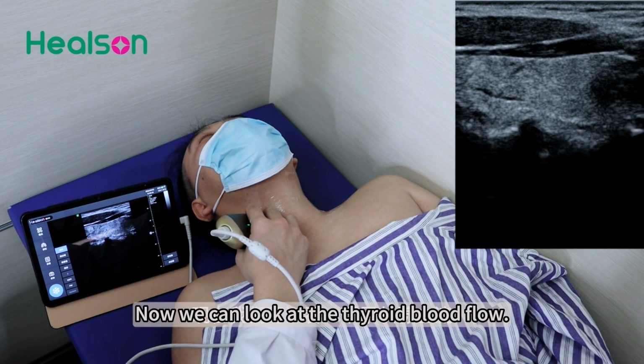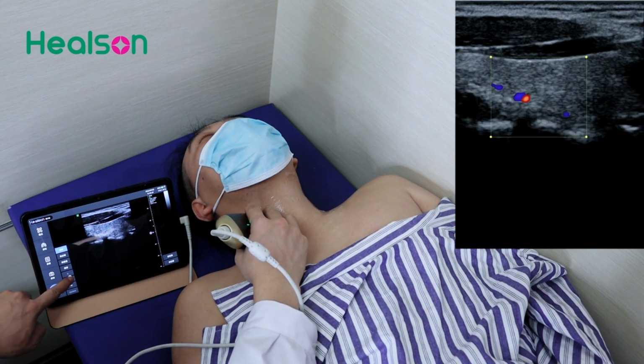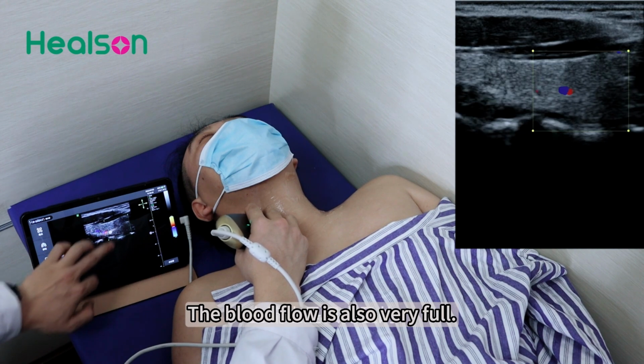Now we can look at the thyroid blood flow. The blood flow is also very full.